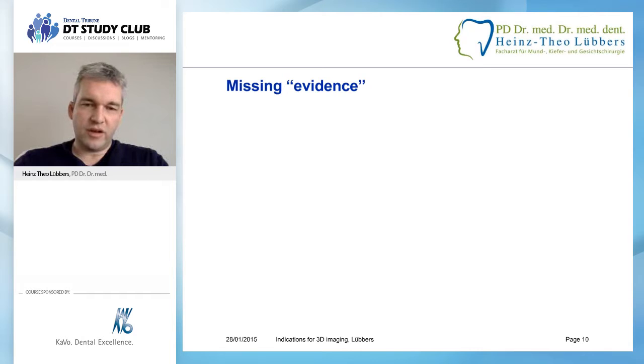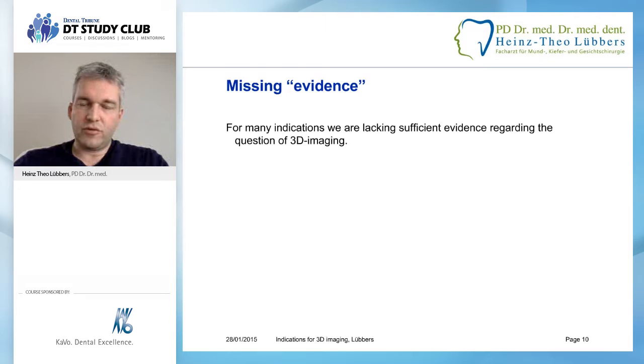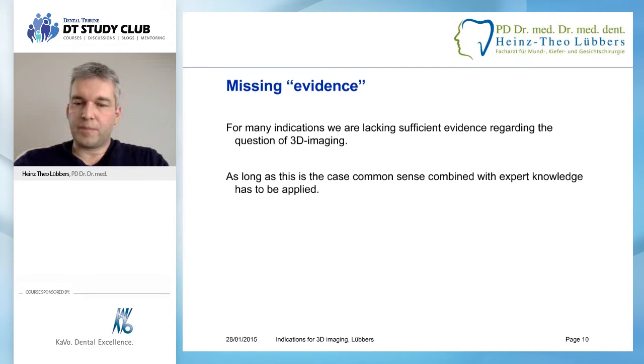When you talk about CBCT nowadays, you have to deal with missing evidence. One problem is that for many, many indications in the dental world, we are lacking sufficient evidence regarding the simple question, is 3D imaging helping the patient in his situation, or is it helping us to help the patient, or is it not? And there's one general agreement about missing evidence. Whenever it comes to missing evidence in the literature, the best you can do is to use common sense combined with expert knowledge.